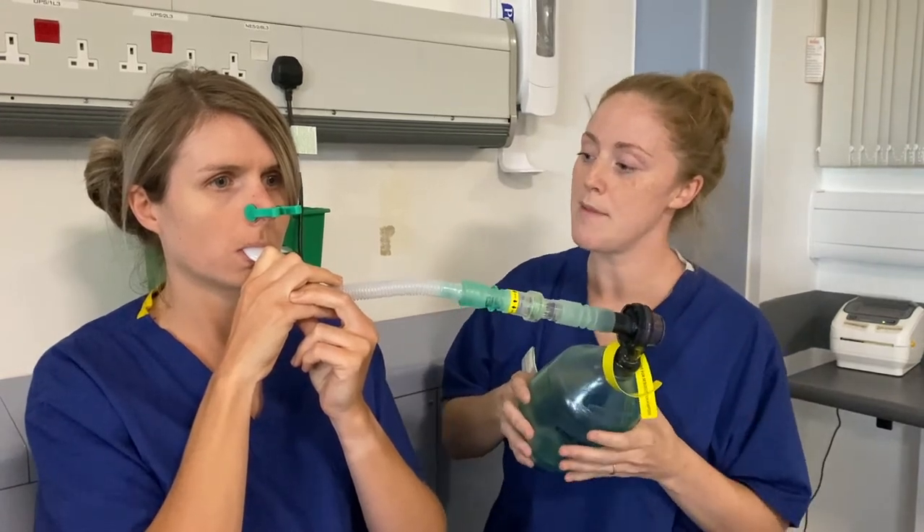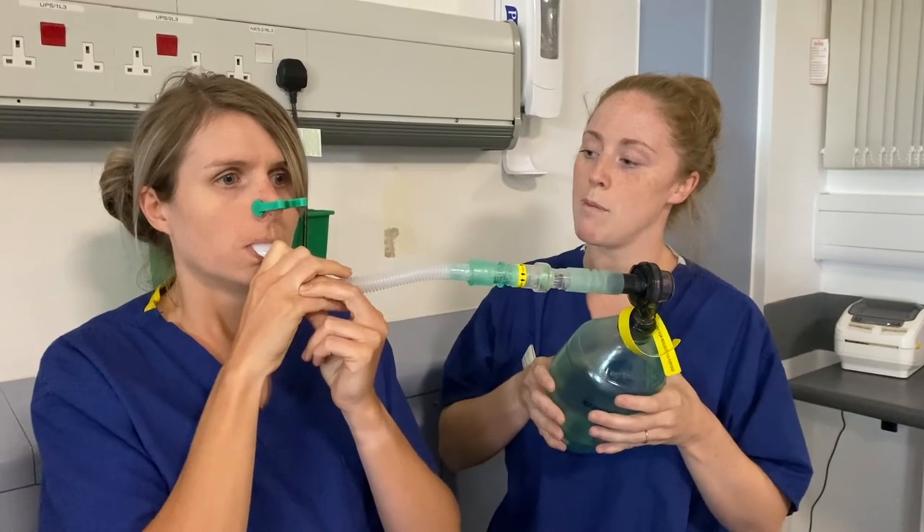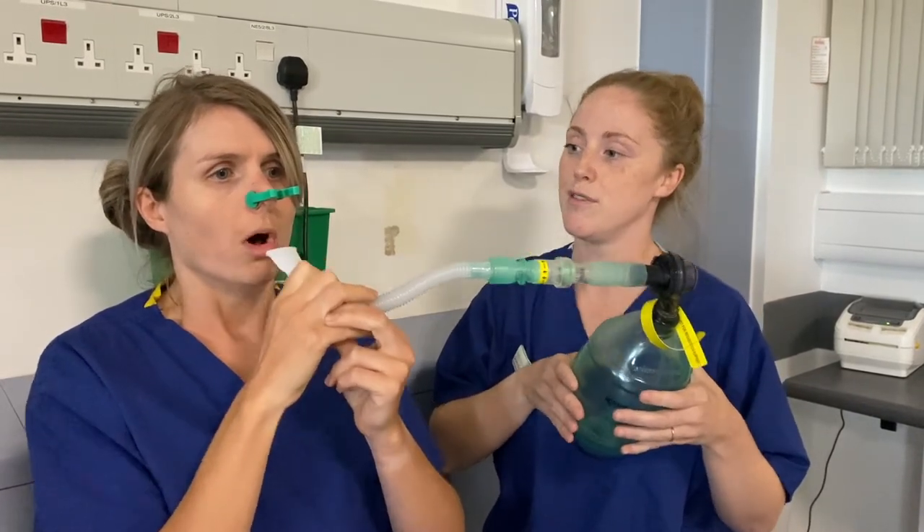You'll be asked to take a small breath in, another breath, and one more breath. You should then remove the mouthpiece from your mouth and have a cough. If you have any questions, please do not hesitate to contact the service.